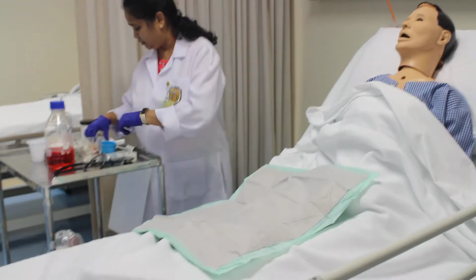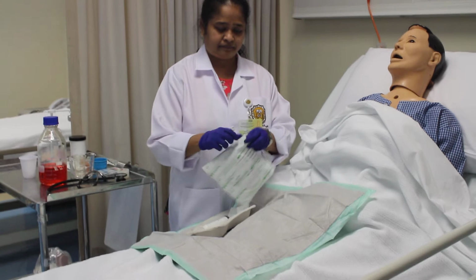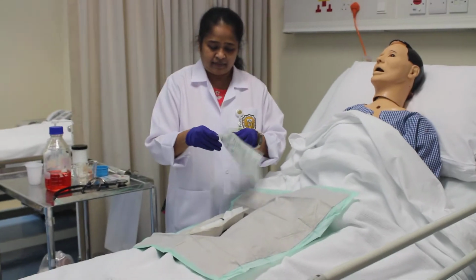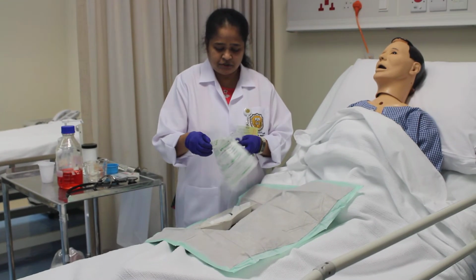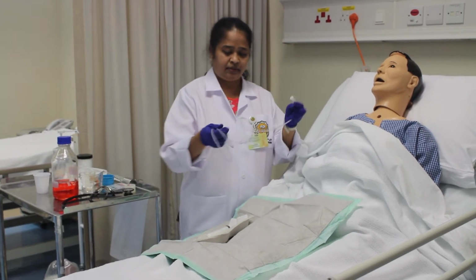Keep pushing. I'm going to open the tube and measure how much of the tube should be inserted inside. How do we measure it?